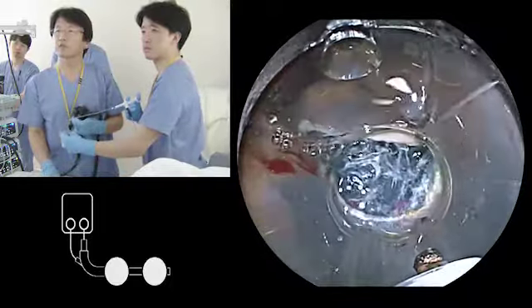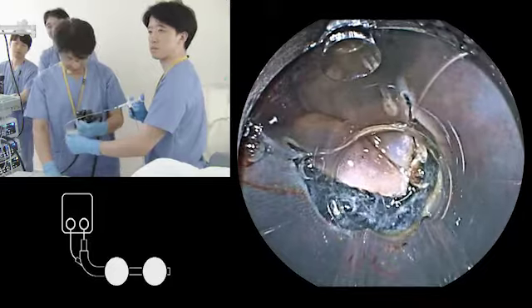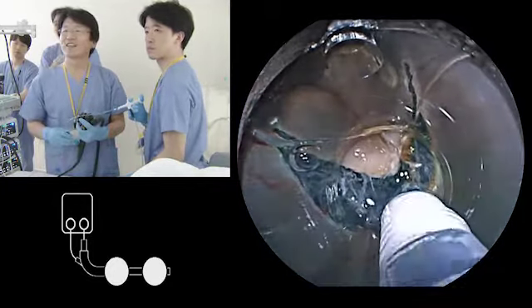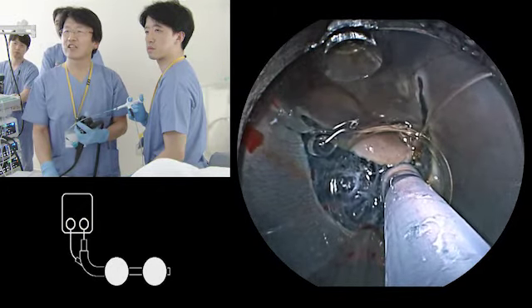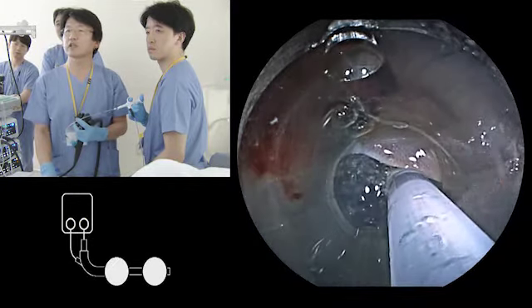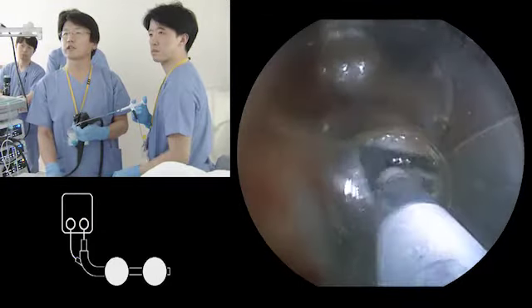Oh, I cut a little bit of mucosa. Sorry. No problem. Too shallow, that was okay. It is important to cut just below the mucosa, yes. It's very safe. Yeah, that is in order to go into the submucosal space with the tip of the ST hood.